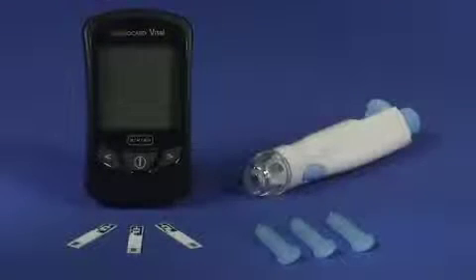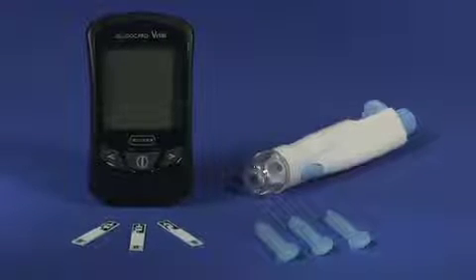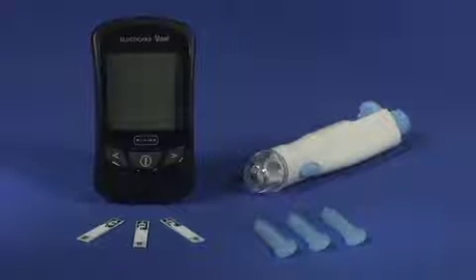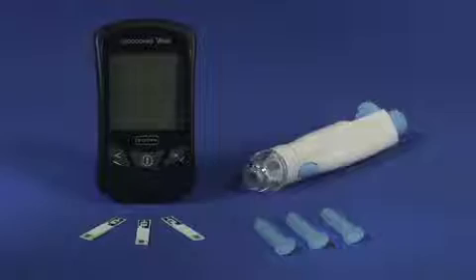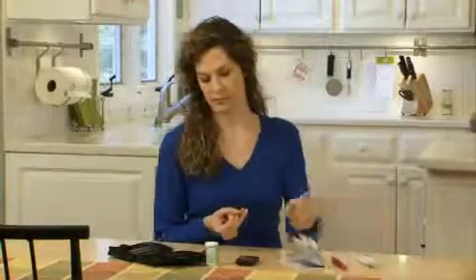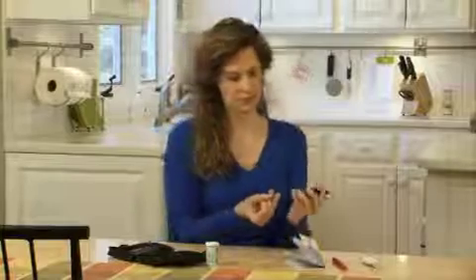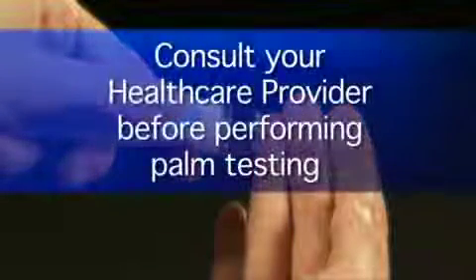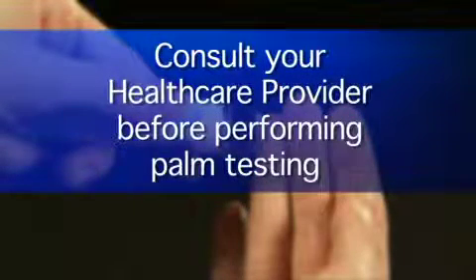To perform a blood glucose test, you will need your Glucocard Vital Meter, Glucocard Vital Test Strips, lancing device, and lancets. Since the Glucocard Vital System requires a very small blood drop to perform a test, we will use the fingertip. Because there are differences in how you perform fingertip and palm testing, speak to your health care provider and refer to the detailed instructions in the Glucocard Vital User Manual before performing palm testing.